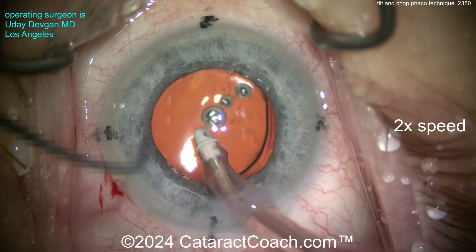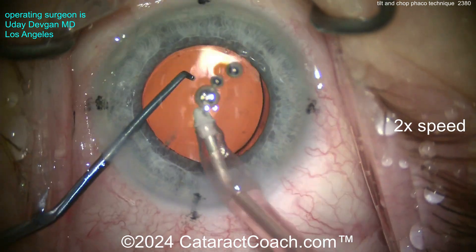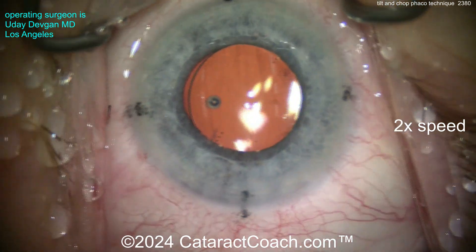Now let's go behind the optic to remove viscoelastic, especially for toric lenses — we don't like to leave viscoelastic behind the optic because that can allow the lens to misrotate out of position. Getting it dialed in: if you look carefully, there are marks on the cornea and we're lining up the toric IOL marks onto those corneal marks.